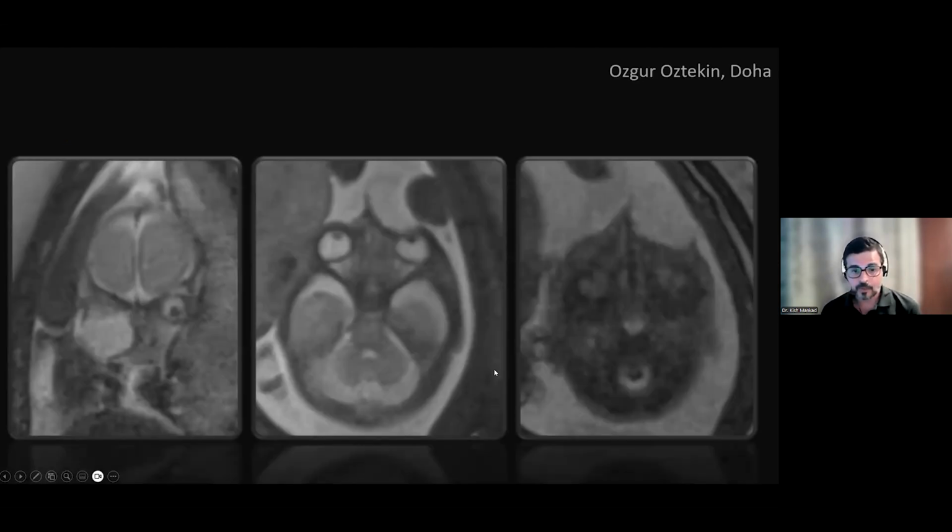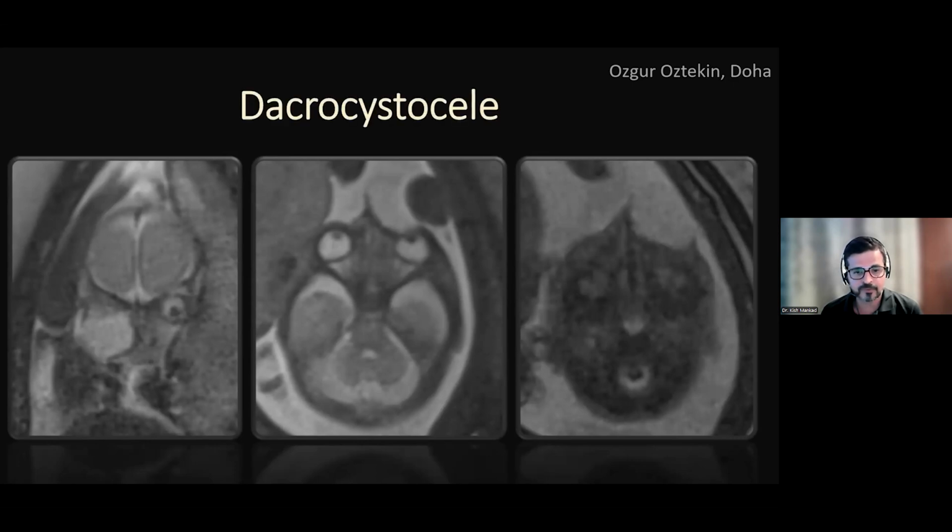Good. We talked about cystic masses. This is the other set of the first of three that I showed to you. The location of this is very typical. This is a case from Ozgur himself, who was then in Doha, but now back at home in Izmir. A good story coming up from him as well later on. And this is a dacrocystocele, as it's typically located where it is.